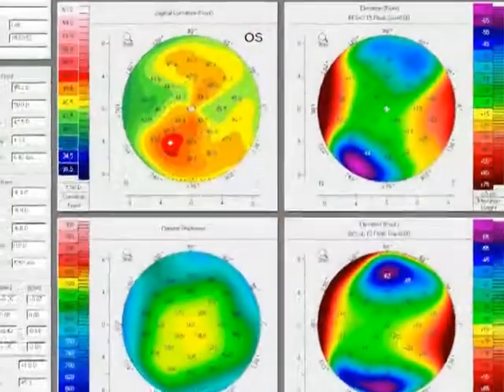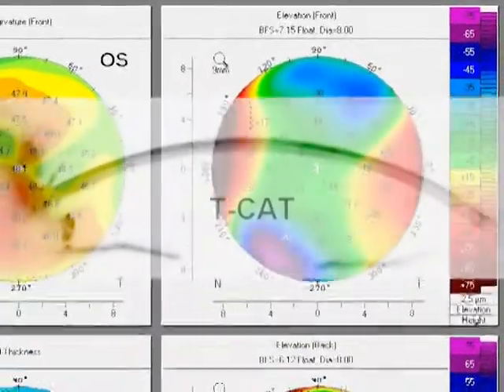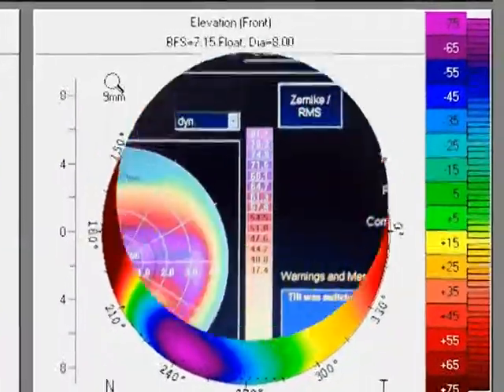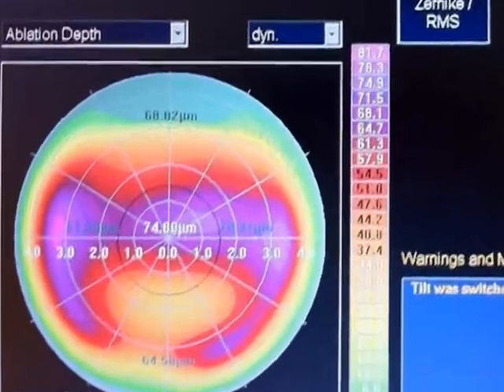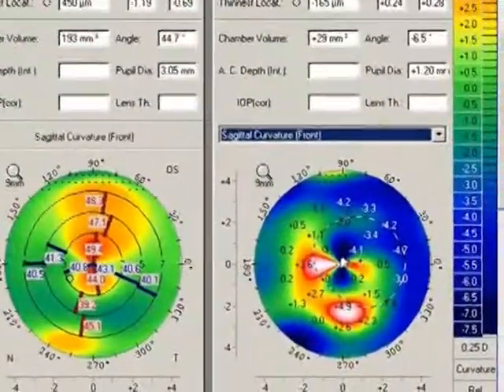Some cases with a cleavage plane between the scarring area and the subsequent corneal stroma require superficial keratectomy. Front elevation data from Placido disc or Scheimpflug imaging allow for a customized topography-guided ablation. The goal of TCAT is to regularize the corneal surface, which typically takes less tissue to treat ocular aberrations. Also, these cases cannot be measured with Hartmann-Shack or Tscherning aberrometry.